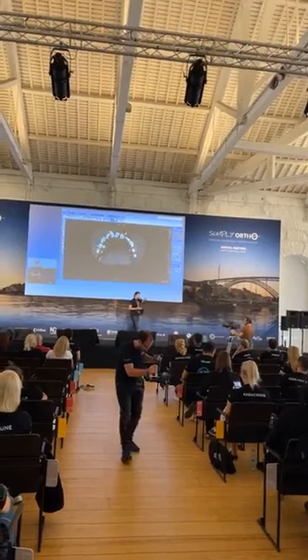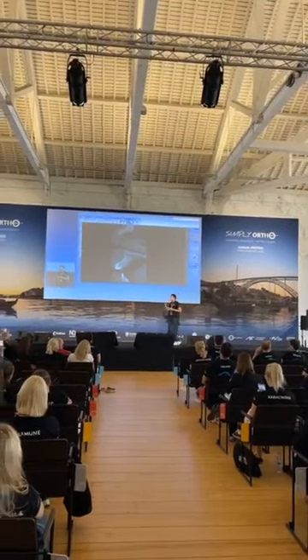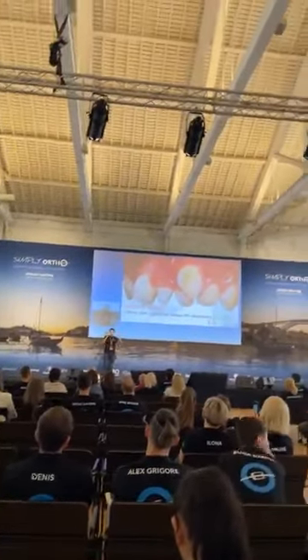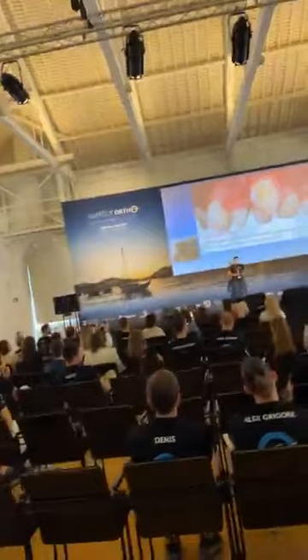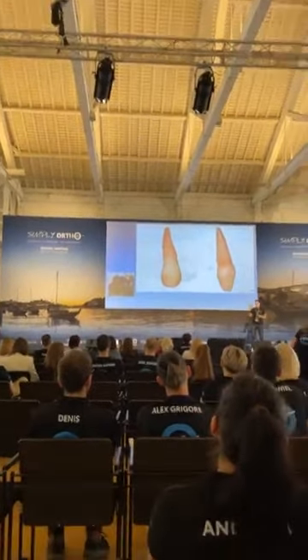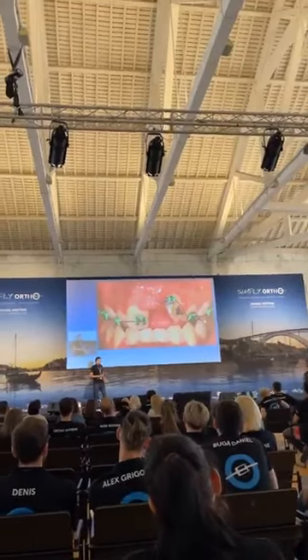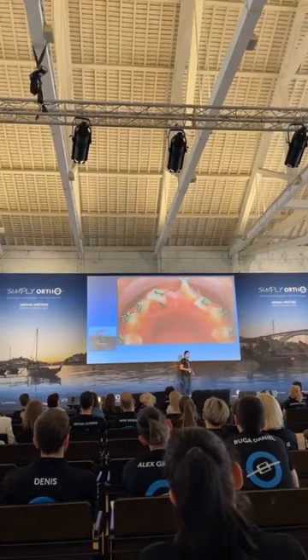So from the CBCT, the upper left central incisor — I can barely see it. Three options were considered: extract the permanent central incisor and shape the supernumerary tooth; or do CBCT-guided surgery for the supernumerary tooth; or extract the supernumerary tooth and rotate the new central incisor — which is a digital option. I went with this digital option: extract the supernumerary tooth, then start bonding by placing a bracket and eyelet on the canine, and close the bracket onto the palatal surface, and start to extrude the tooth. After extrusion, the tooth moved inside the bone, bone formed, and the tooth moved down.